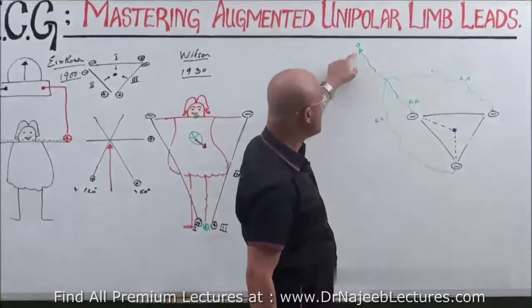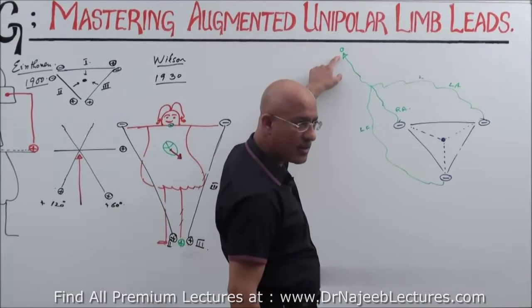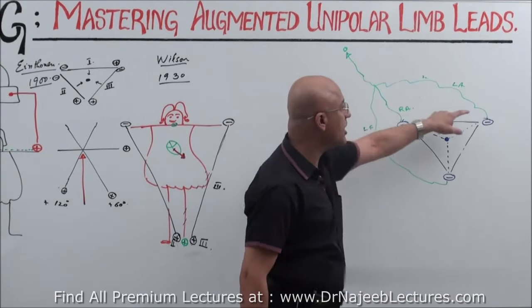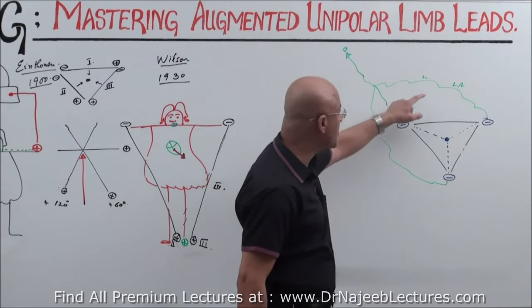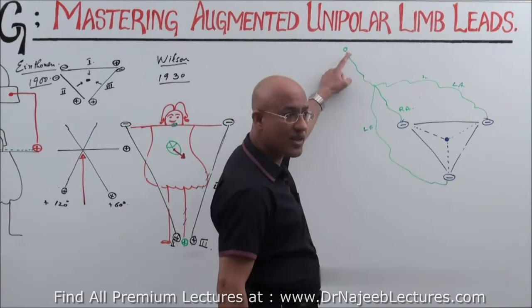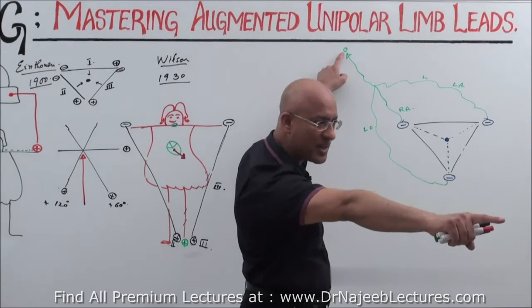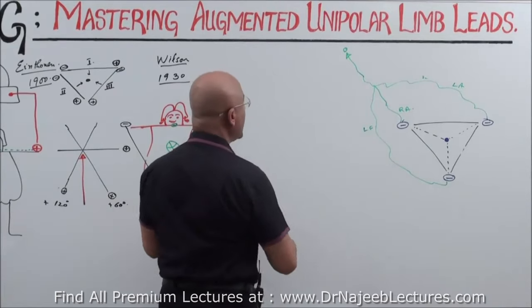If this wire is connected to the negative terminal, it will be called the common terminal, because it is taking information from multiple points and adding them together. So these three wires are united into a common wire. When it ends up on the machine terminal, that terminal should be called the common terminal. Is that right?